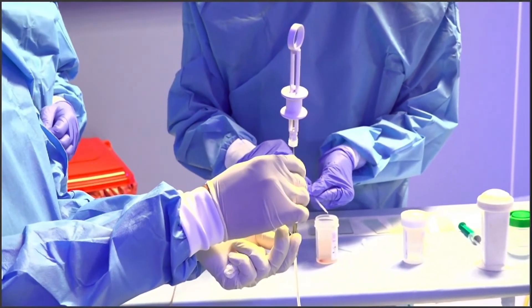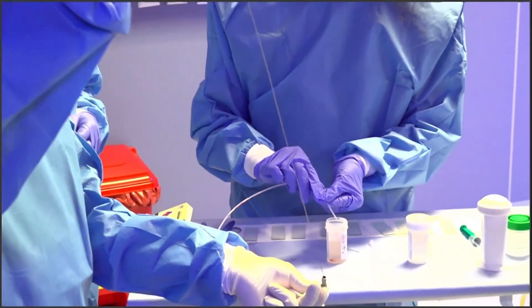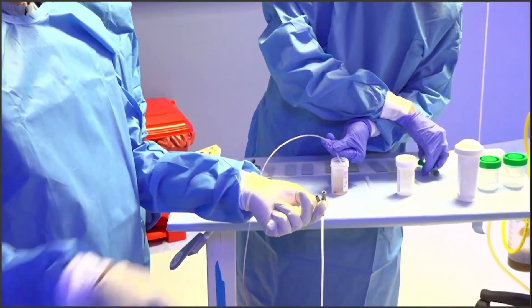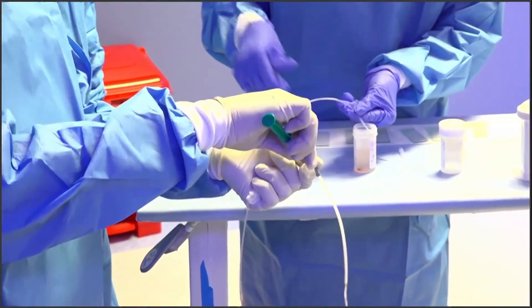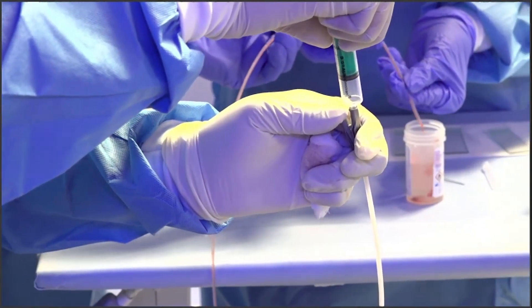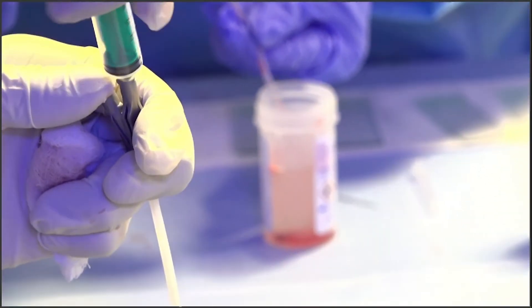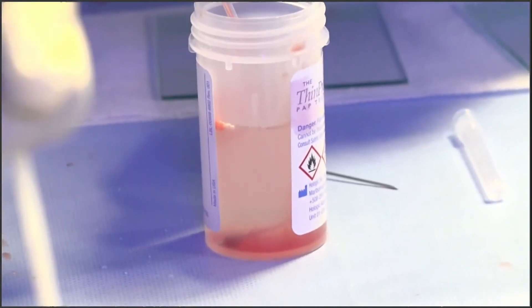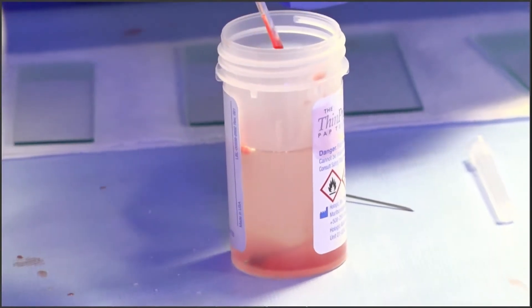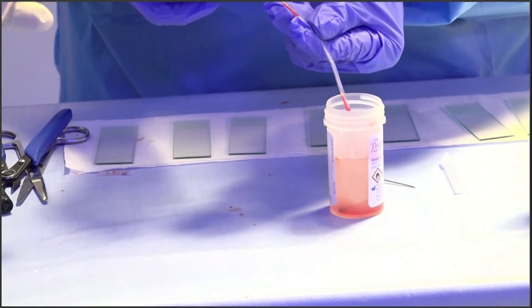The next step is to detach the brush along with the guide wire. Once we remove the handle with the guide wire, we flush air through the sheath. Whatever material remains in the sheath gets expelled and should be collected directly into the Cytolyte fixative, combining with the material already there. This helps us salvage as much material as possible for optimal cytological processing.